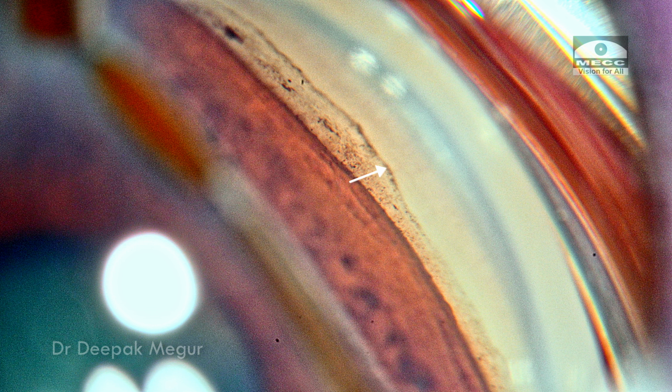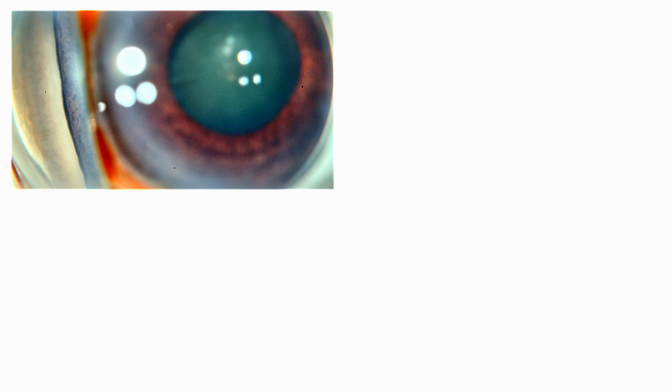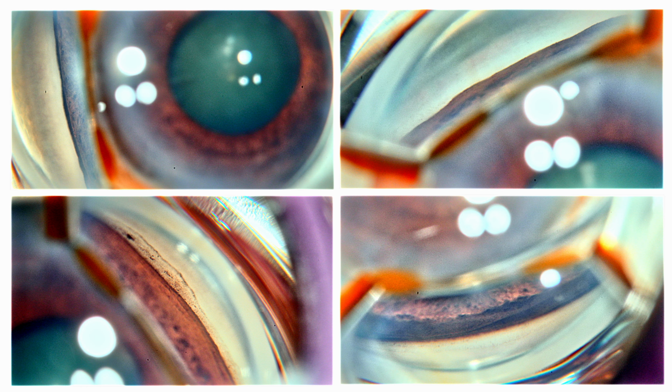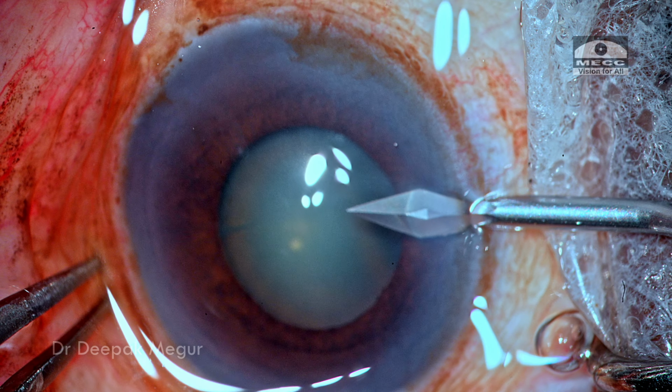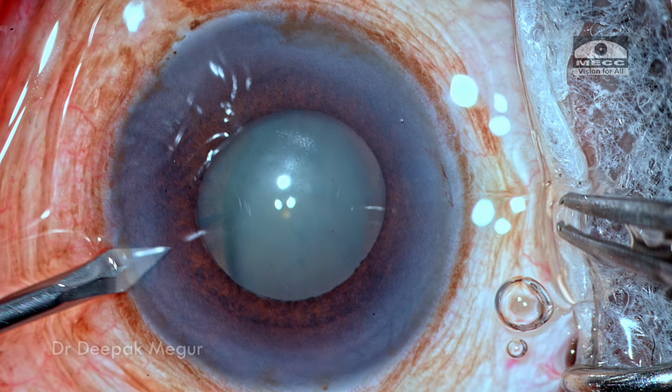Schwalbe's line. This is not to be mistaken with Schwalbe's as a trabecular meshwork, but this is a Sampaolesi's line. And in this quadrant, the pigmented trabecular meshwork is just faintly visualized. So in most of the angle structures, the pigmented trabecular meshwork is not seen. Let's see how the angle changes after the lens extraction.